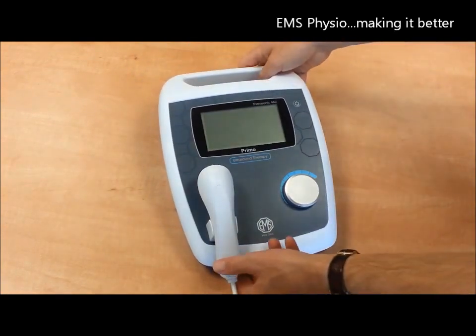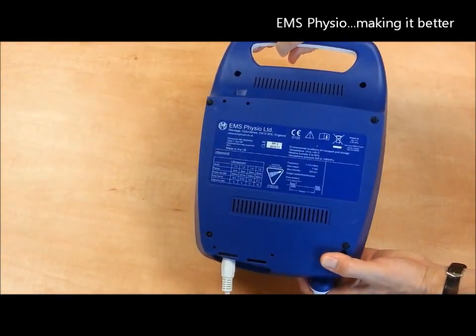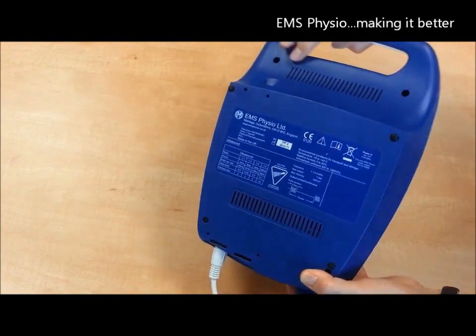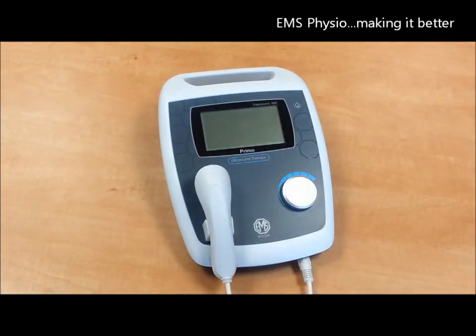The labelling is clear and concise and conforms to all the required standards for CE marking to the medical devices directive. It is a portable, lightweight device which is mains powered.